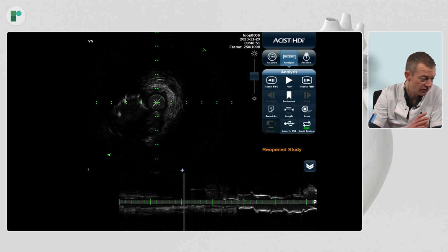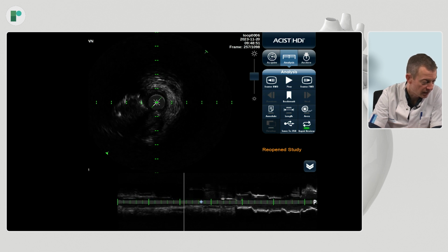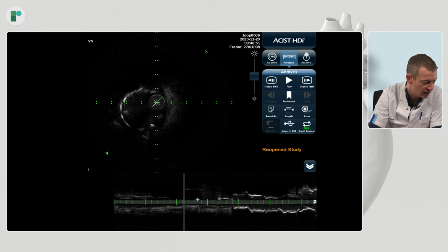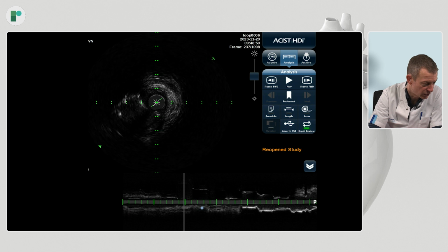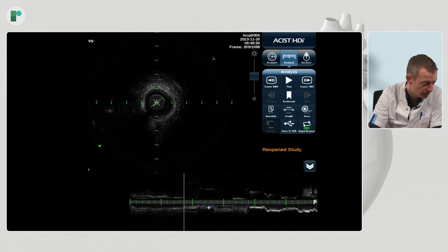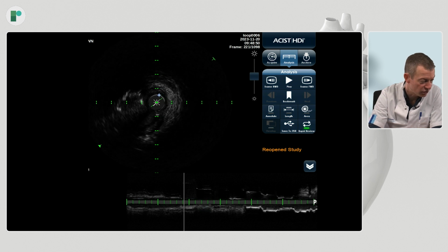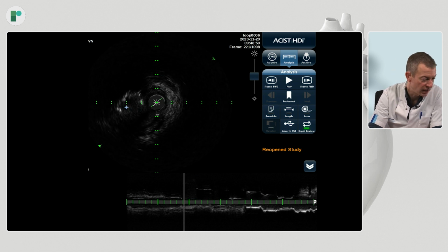But this is just for the sake of demonstration that here we took a real proximal strut, and that's easy to appreciate. Here is the proximal part, I go a little bit distal, you immediately see stent on the side, and here is the side branch. So this is very clear. We took a very proximal strut. And for now, I would say it doesn't matter, because you can see that the ostium of the diagonal is completely free of disease. You see that the 1.5 balloon really didn't modify that much the stent and the LAD.